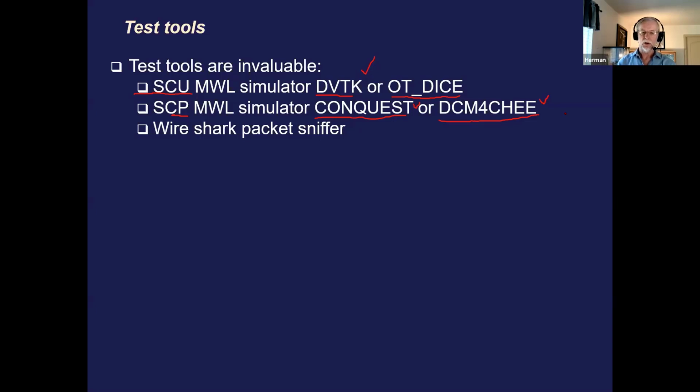You can actually send an order, simulate an order, and query against it. So with these simulators, the idea is you have, let's say, an ultrasound and a Modality Worklist provider. You want to be able to replace both the SCU and SCP with a simulator. So we can simulate either the queries from a different destination and can see what's going on, or the SCP, what's going on. And then we can connect the packet sniffer in the process, right?